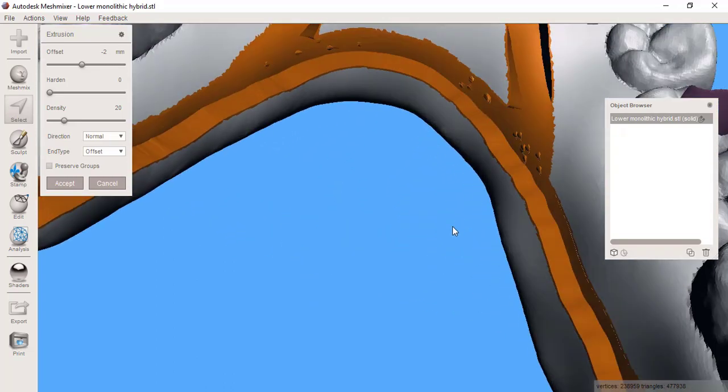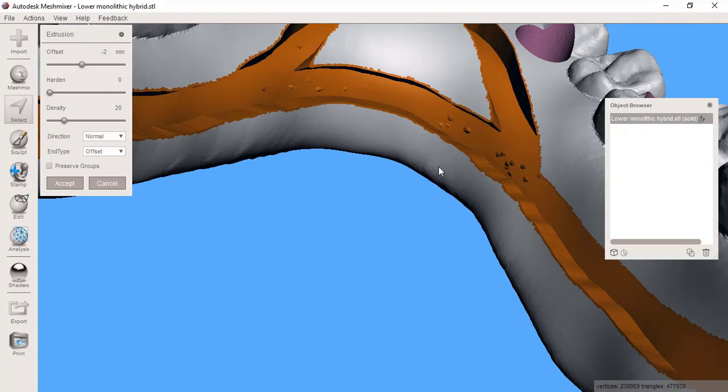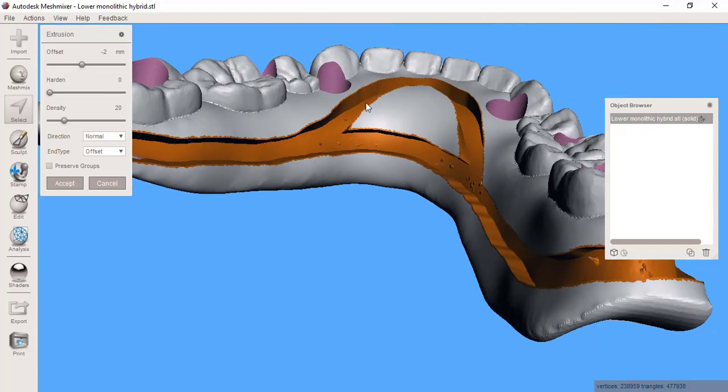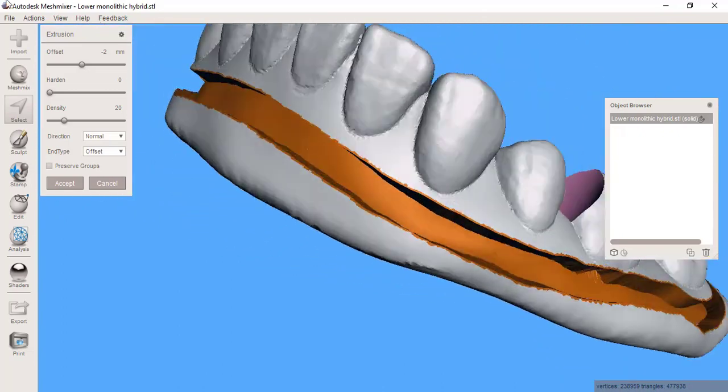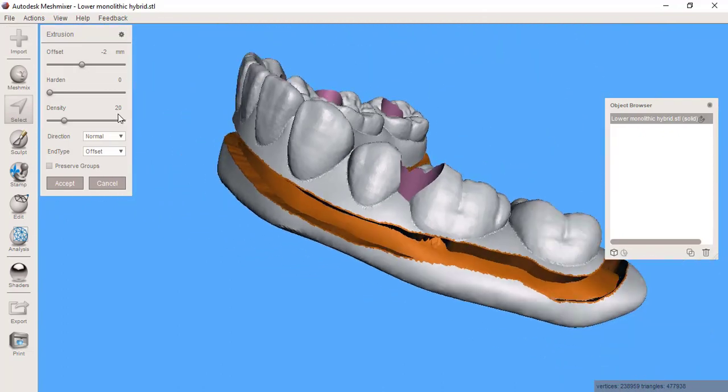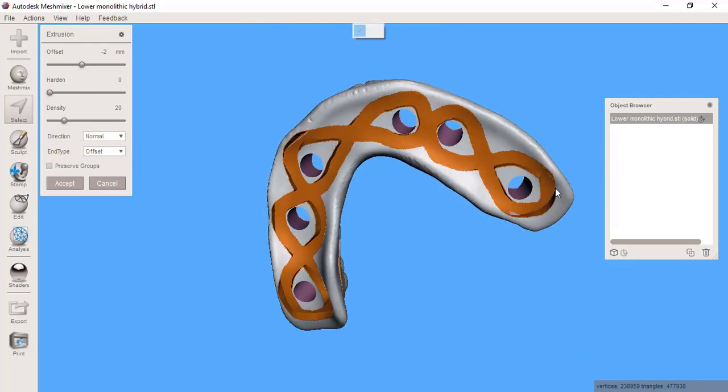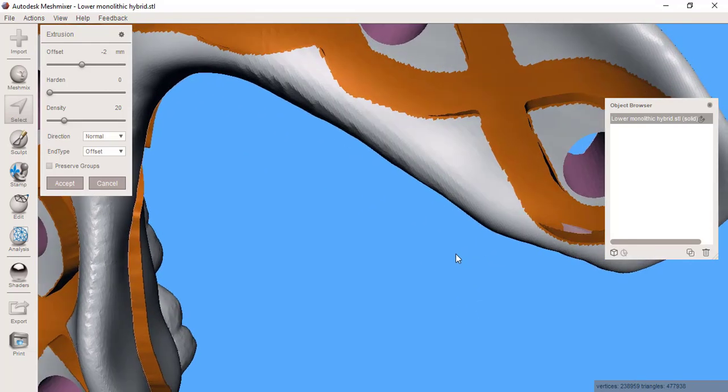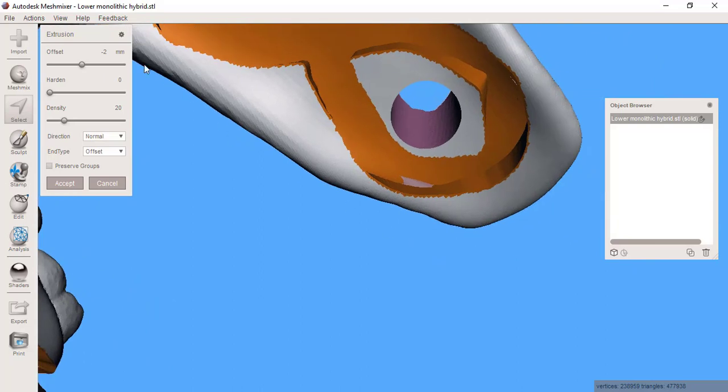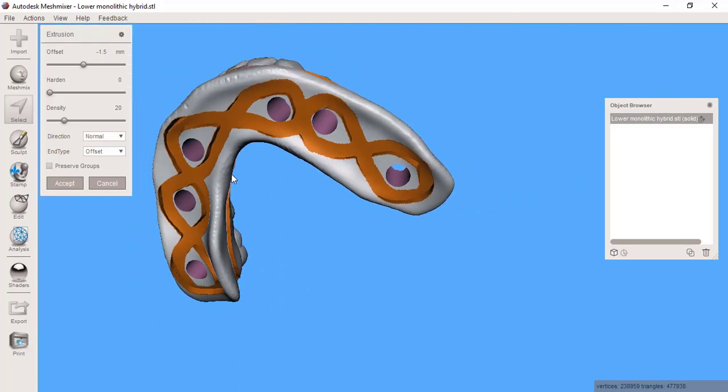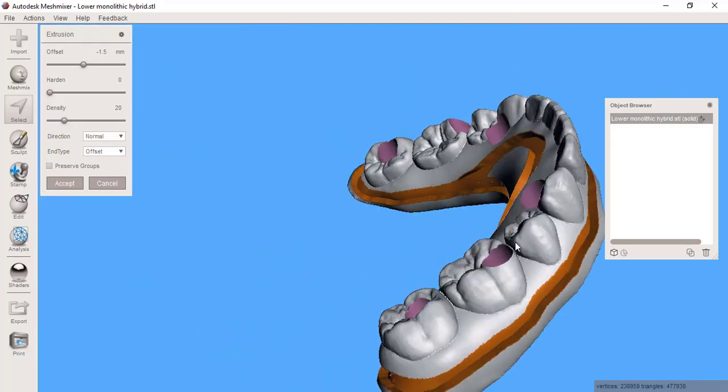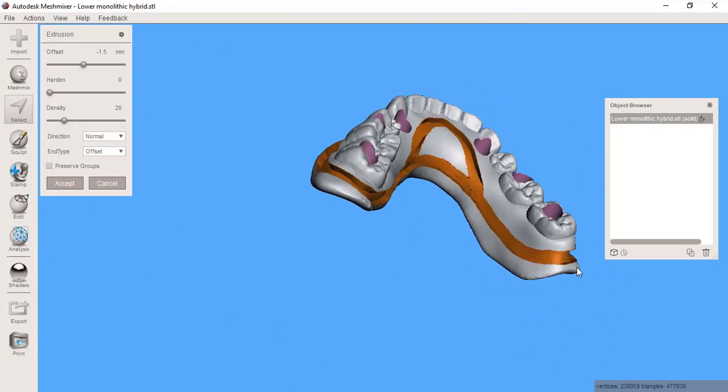I do see there's a couple little spikes and areas in here that are not going to be ideal. Right in here you can see that the mesh is showing through where it's crossed over itself. So let's take that down a little bit, go to 1.5, and I like that a little bit better.